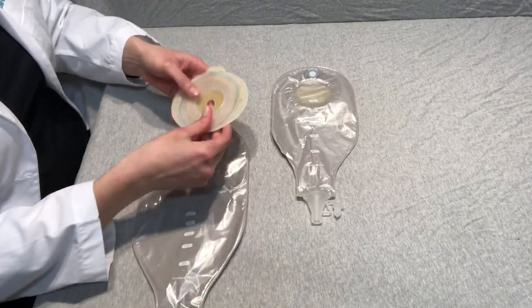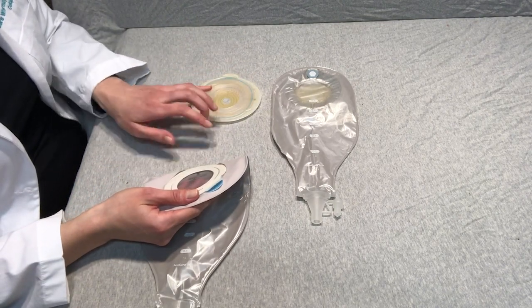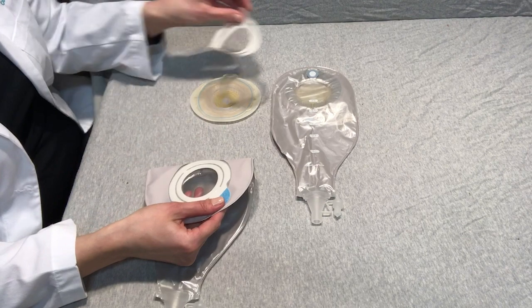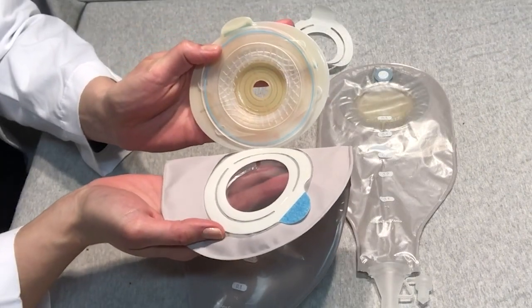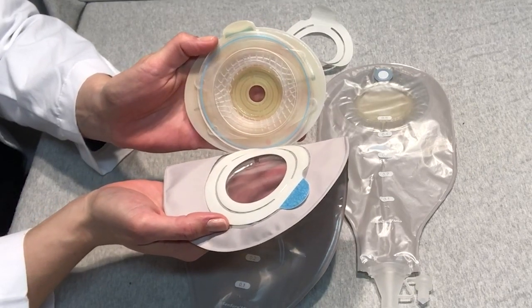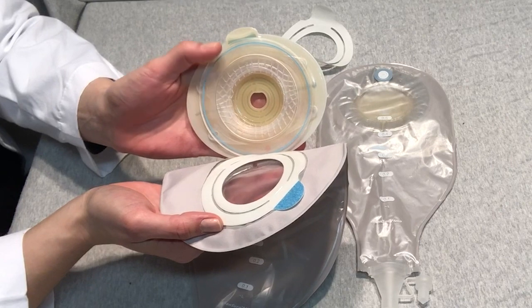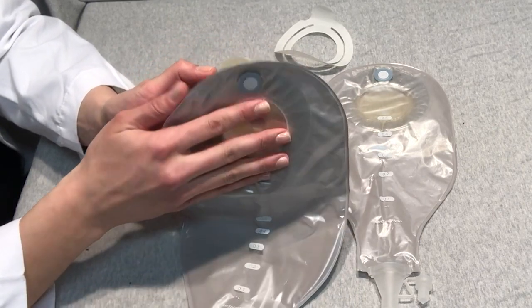As far as applying the pouch to this flex barrier. After this is completely prepared and cut out to fit the patient, I'm going to peel off the backing here. You're going to line up the bottom of this pouch with the circular blue line on the landing zone. This landing zone has to be clean and dry prior to applying and doing this step. And you're going to apply.